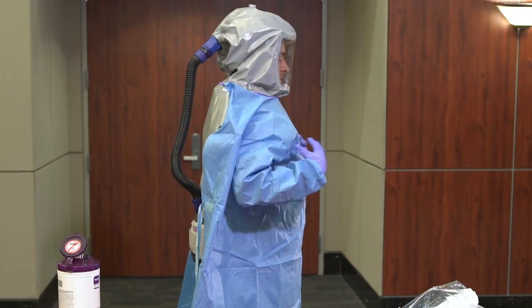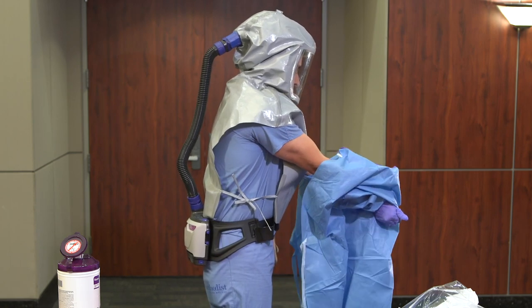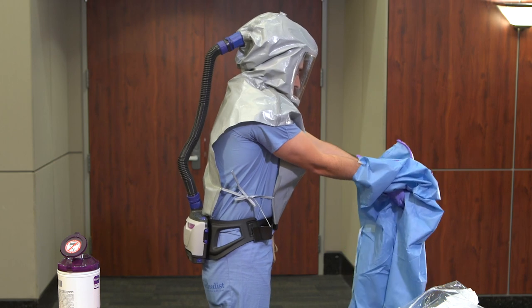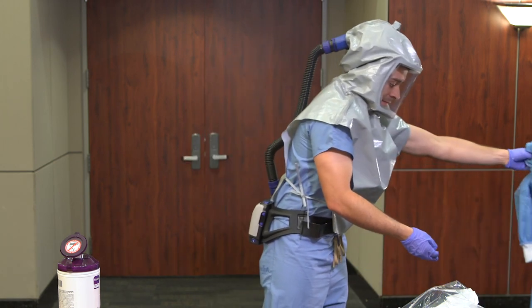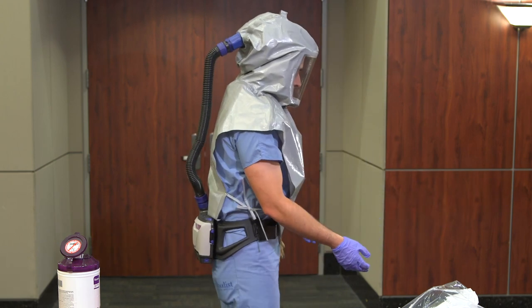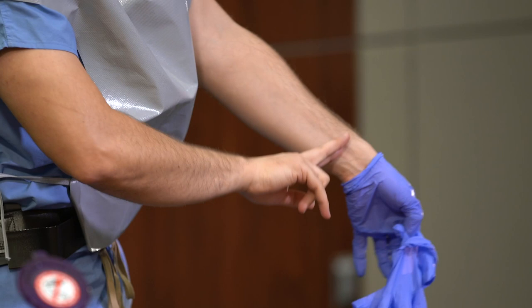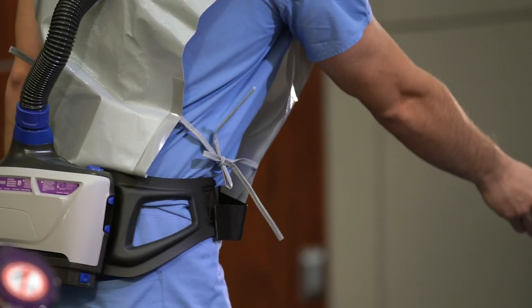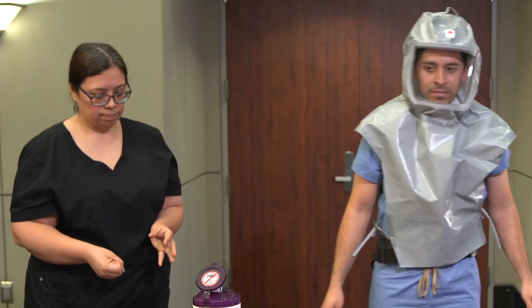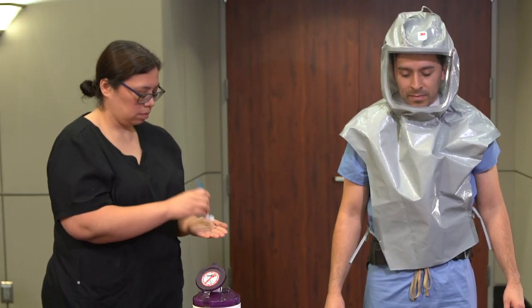Grab the gown at your chest and pull forward. Do not bunch or twist the gown, and discard into a waste container. Doff gloves using glove-to-glove, skin-to-skin technique. The buddy should then perform hand hygiene and don new clean gloves.